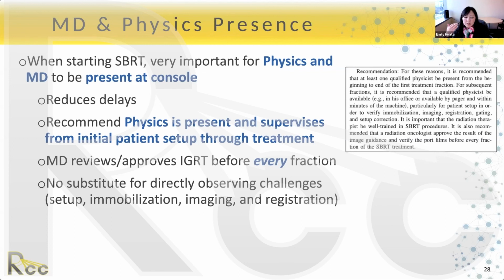And so while we certainly encourage the therapist to always call physics whenever there's anything like that, sometimes the therapists are busy. Oftentimes they're just trying to get through. They think they're very capable of problem solving it. And so sometimes they'll just work through it. And as physics or physicians, we don't hear about these things until maybe after the fact, and it would have been important to know about it early. So especially when starting out SBRT, and certainly as the program evolves, it's really important to have physics present from the initial patient setup through treatment.